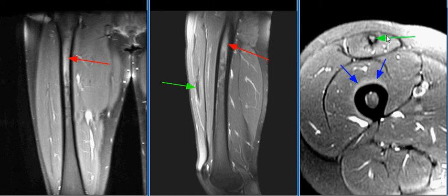There is a chronic tear of the indirect tendon of the deep head of the rectus femoris muscle with tendon retraction and fibrous encasement, as seen on this image with the green arrows.